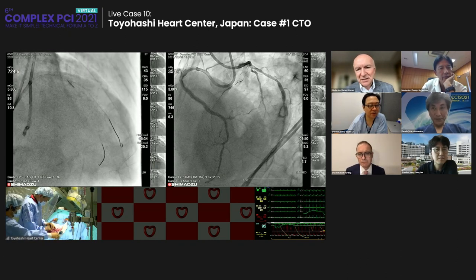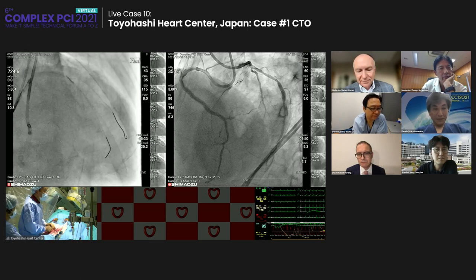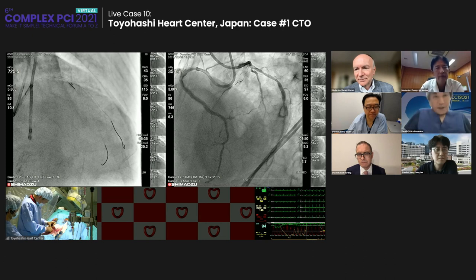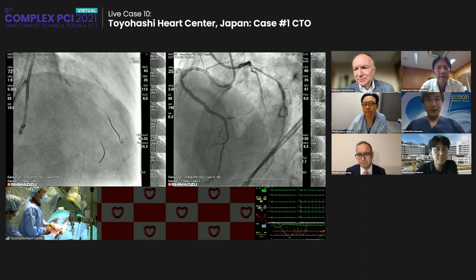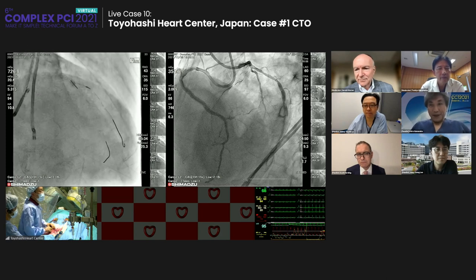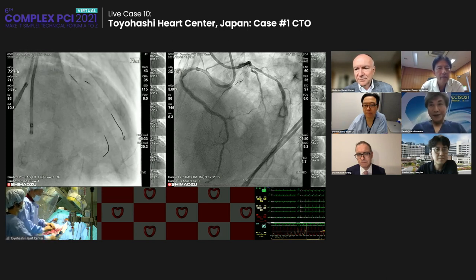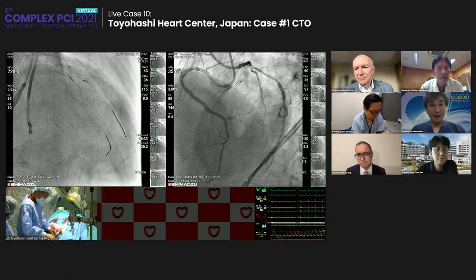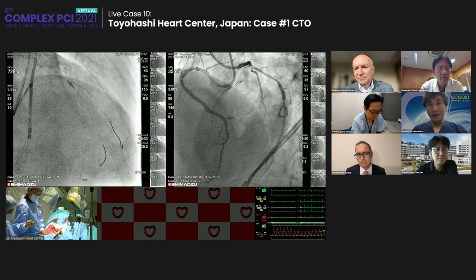You're muted, Gerald. So I think, first, dilate the diagonal ostium by balloon, and then check the angiogram. And then if the result is wrong, I think I should do the two stent strategy for this case.